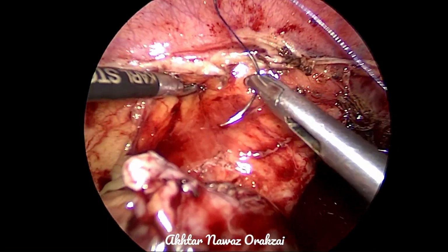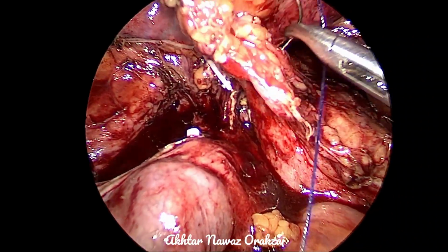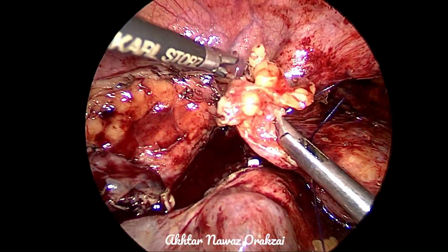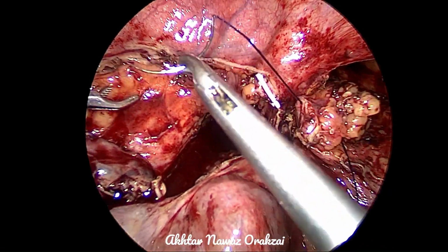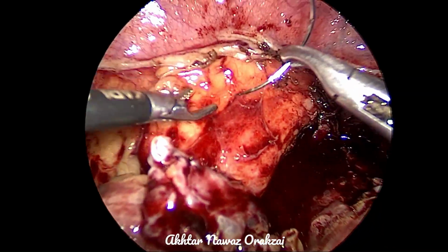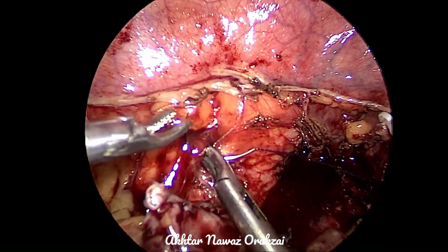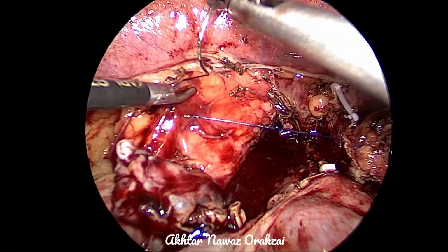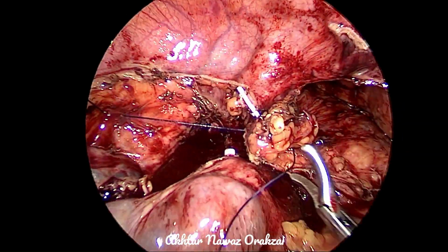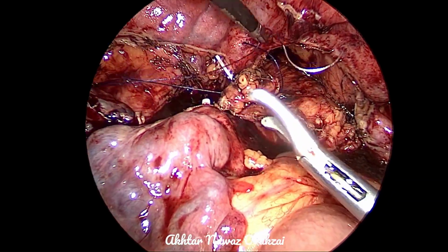The bladder wall, if taken, will give tension, and too much stretching of the bladder wall and detrusor will lead to voiding dysfunctions. So this muscular fascia is connected with the extravesical tissue along with the peritoneal layer.